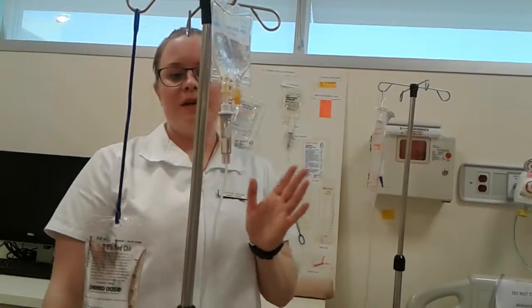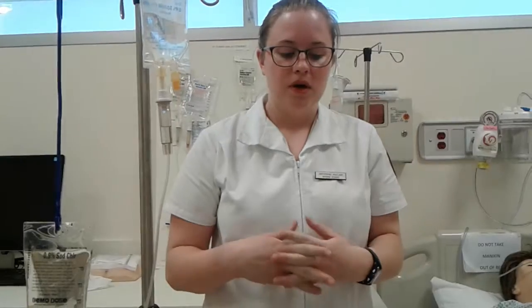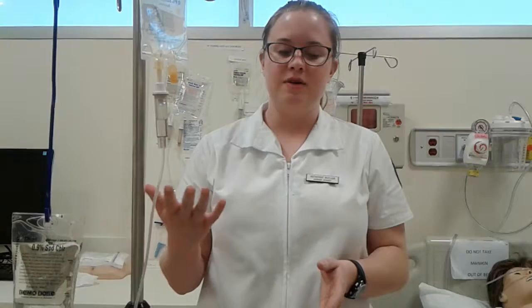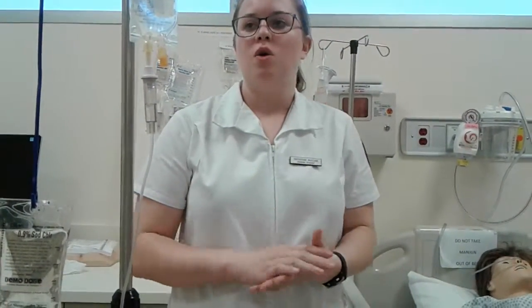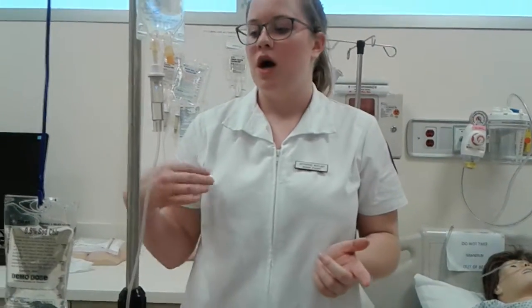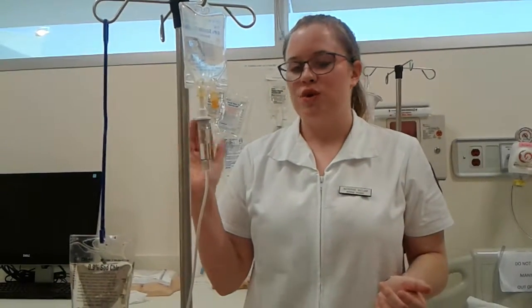So now that the IV has been set to the proper drip factor, I would allow the solution to completely infuse into the patient. I would then lower the bed and wash my hands, allowing the IV piggyback solution time to infuse. After it's completely infused, I would come back in and wash my hands. I would completely clamp the IV piggyback tubing. I would remove the old bag and raise the primary IV solution while setting the drip factor to the prescribed drips per minute.